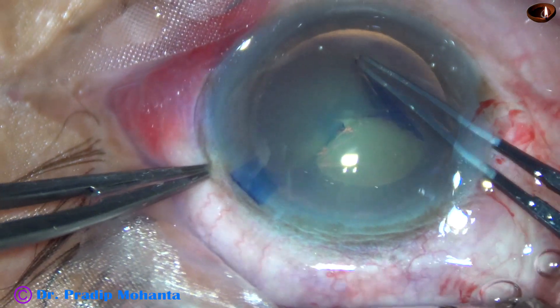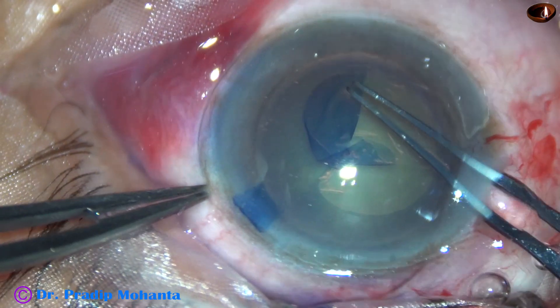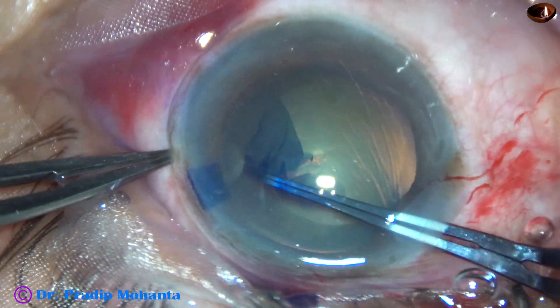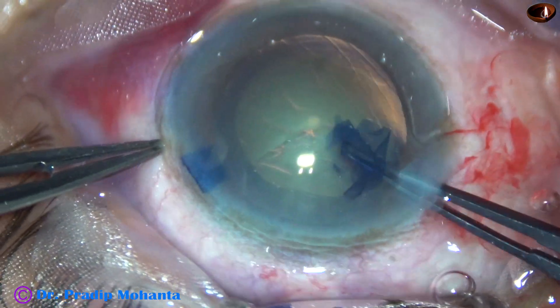This is capsulorhexis with the help of capsulorhexis forceps. The size of the rhexis is about 5.5 mm.